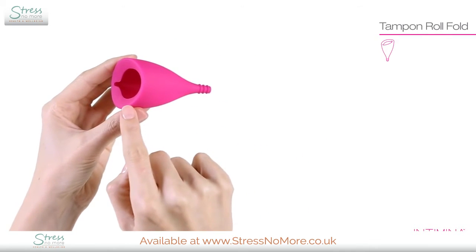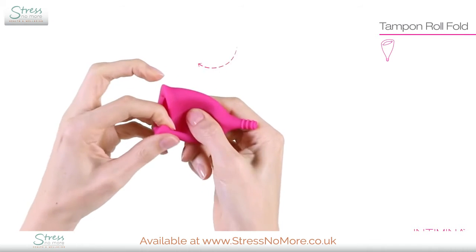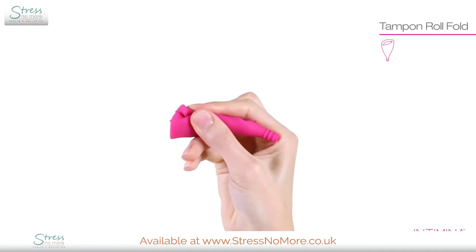Hold the cup with the shorter rim facing you. Flatten it, then tightly roll it up — just like this.